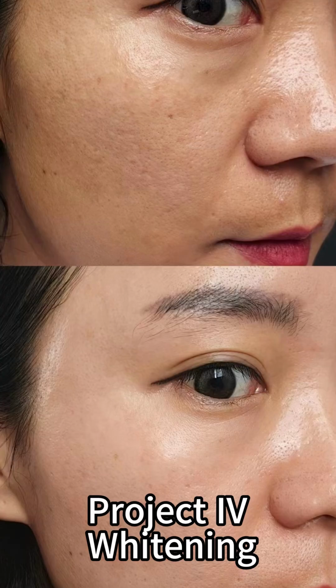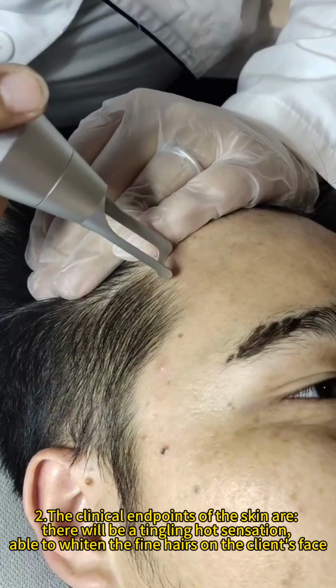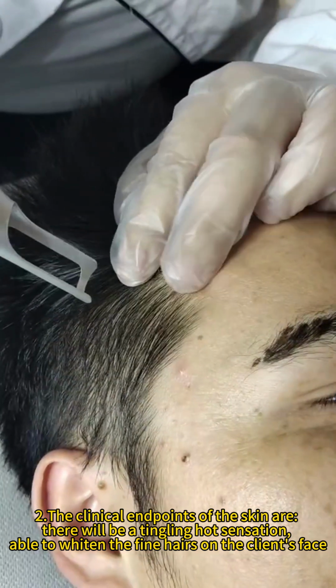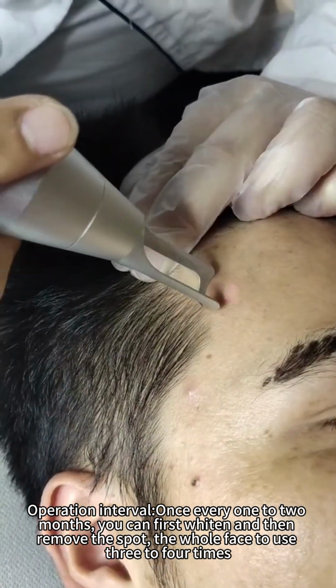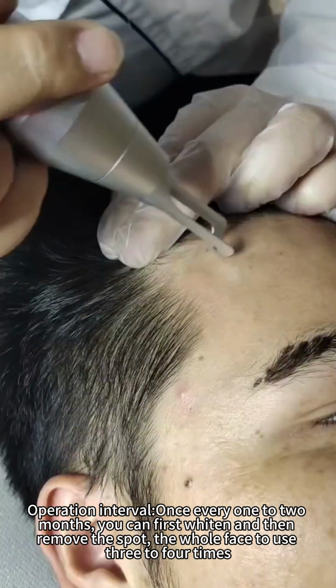Project 4, whitening. Recommended starting parameters: energy from 3.5, spot 7 to 8, frequency 6 to 7, wavelength 785. The clinical endpoints of the skin are a tingling hot sensation, able to whiten the fine hairs on the client's face. Operation interval, once every 1 to 2 months. You can first whiten and then remove the spot, the whole face to use 3 to 4 times.